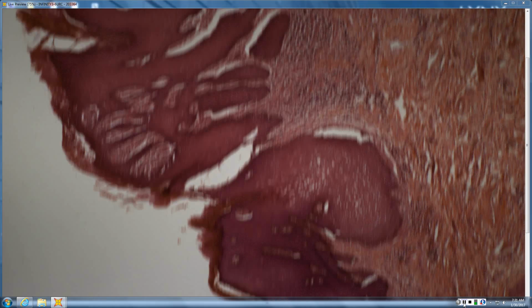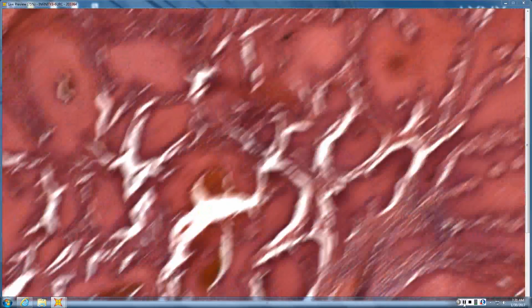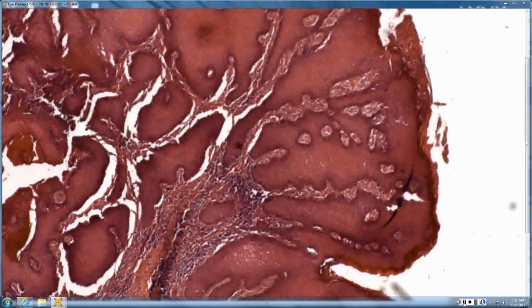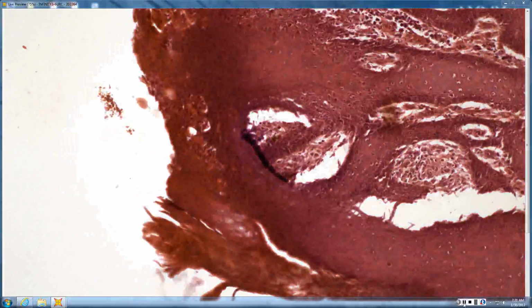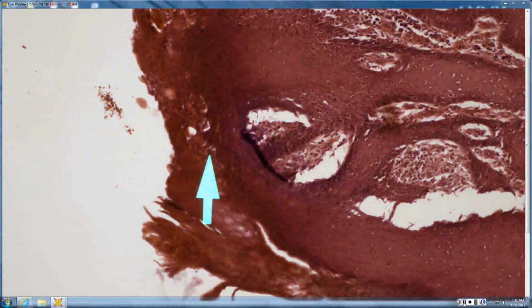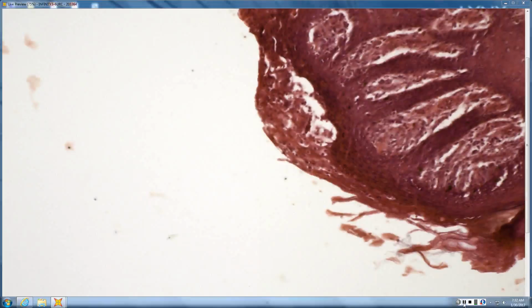And one of the more critical diagnoses we make in terms of risk to patients. So I'm suspecting pseudoepitheliomatous hyperplasia. So big pseudoepitheliomatous hyperplasia. There's some neutrophils. So inflammation, neutrophils in the corneum, kind of a scale crust.